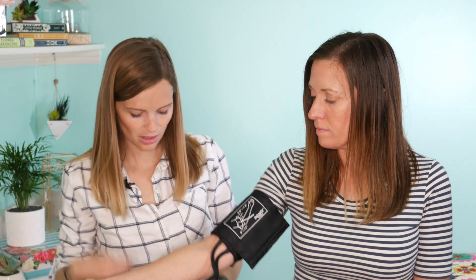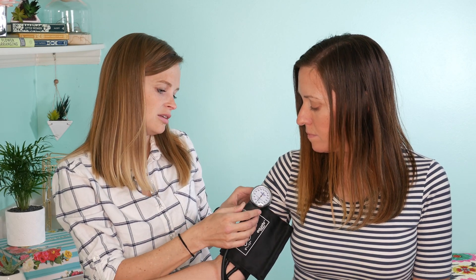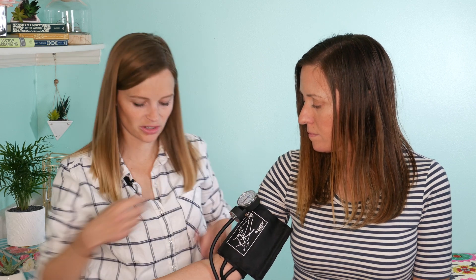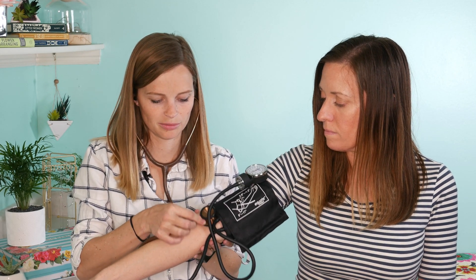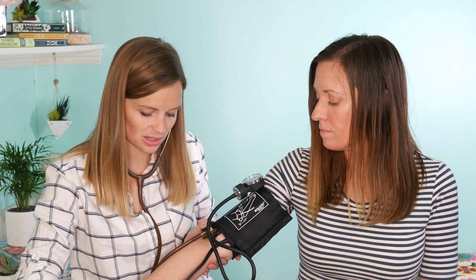On my cuff, the gauge has a little clip on it that I can attach so I can look at it without having to hold it with an extra hand. Then I'll get my stethoscope — this part goes right under the lip of the cuff, just right under on her arm on the skin. I'll hold that with one hand.